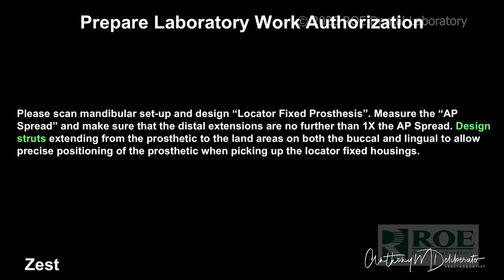And so a locator fixed course like this, if we were just talking about parts and pieces, we'd be here an hour or two. One thing that I don't like when I go to CE courses is when I see a practitioner, maybe at several meetings, and they show this great case, where they started and where they were done, and then you have no idea how they got there. So this is why I put this detail into my lectures for you.